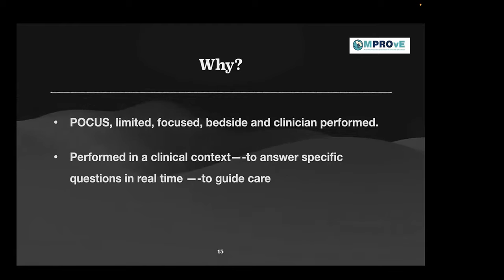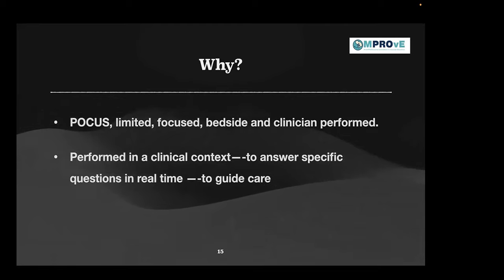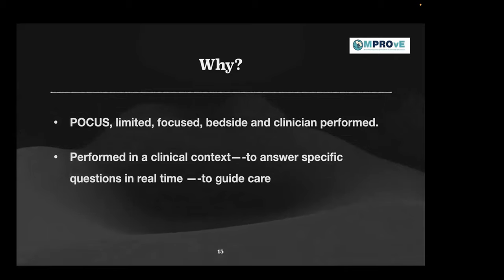Right. So I think we all know why we do ultrasound scans, and I'm talking about point of care ultrasound, which encompasses the lung ultrasound as well. So it's very limited, it is very focused, and it is always done at the bedside, so you don't have to move your babies or patients anywhere, and it's always done by the clinicians.